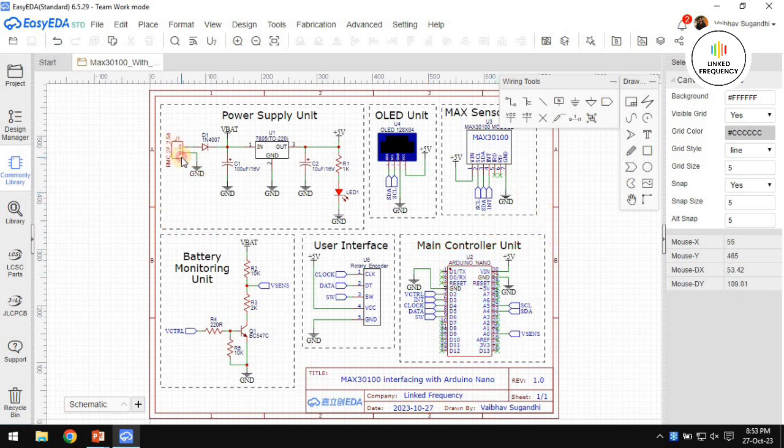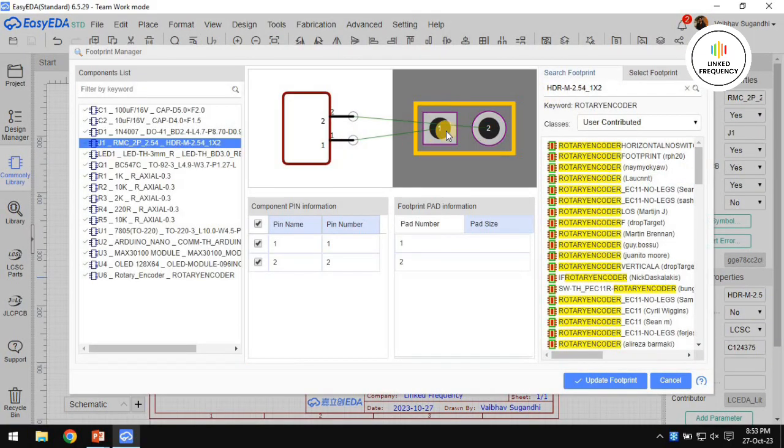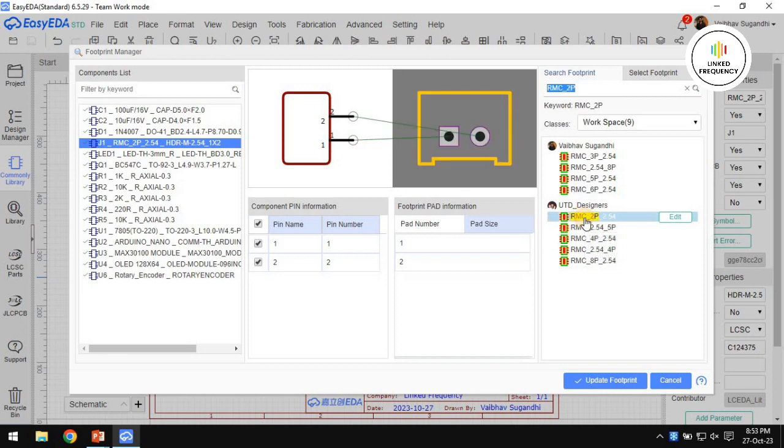Now we need to change the footprint for this particular component because the RMC connector has to be updated with a footprint. This is a normal Berg header or normal header connection footprint. So now I'll change it to the RMC 2-pin connector. I think we designed our own footprint a long time back, and I'm going to use the same thing. You can see here we have an 8-pin, 3-pin, 5-pin, 6-pin, and from our other company UTD Designers, we have a 2-pin. So I'll select it and I'll update it.